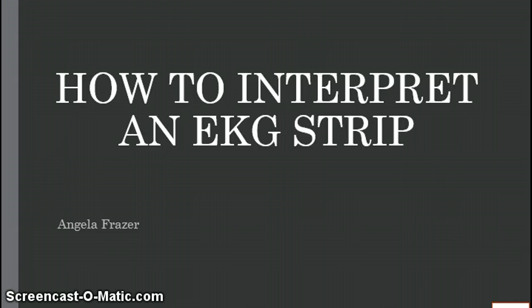In this course, we will be discussing and learning how to interpret an EKG strip and why. We will also be learning the most common rhythms seen on an EKG strip. I want to remind you, this course is not intended for you to become an expert in EKG readings, but to become familiar with the readings to be a safer nurse.